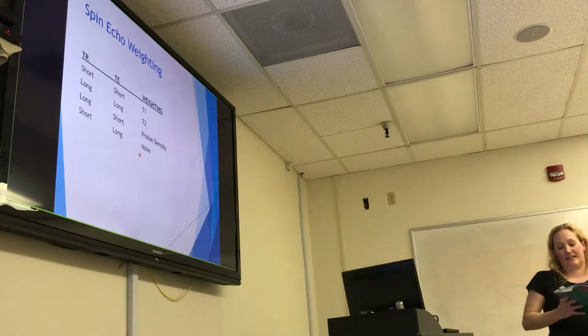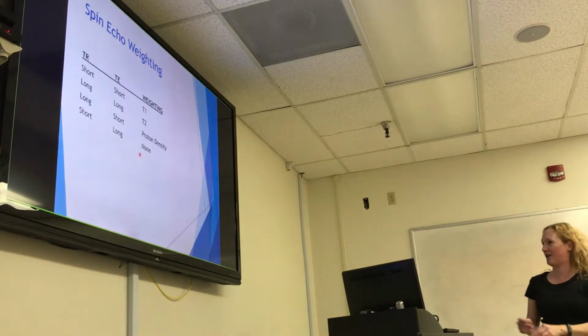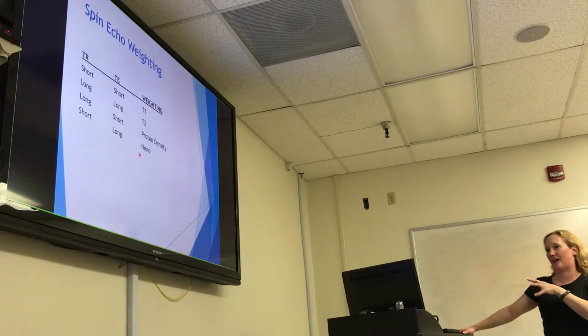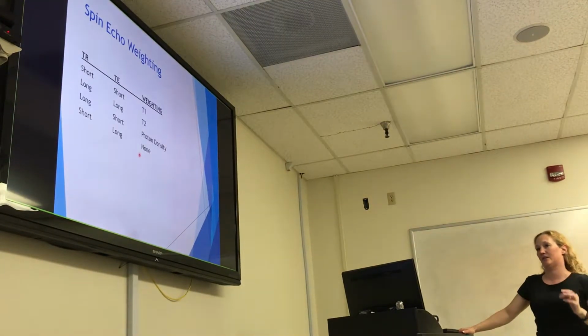So this is our proton density. Like I said, I don't particularly care for this graphic, but somebody asked the question, so I wanted to try to explain it. I don't remember who it was at home. Did that make more sense, what that graphic was talking about, the heat analogy? Yeah? Okay, good.